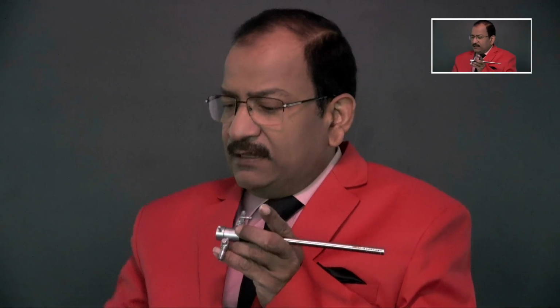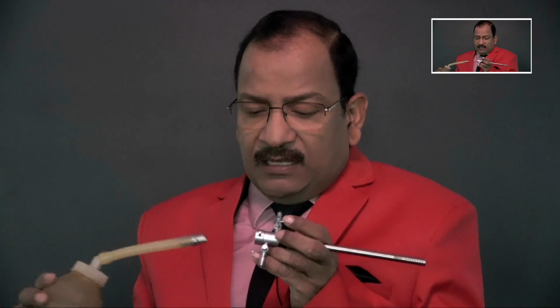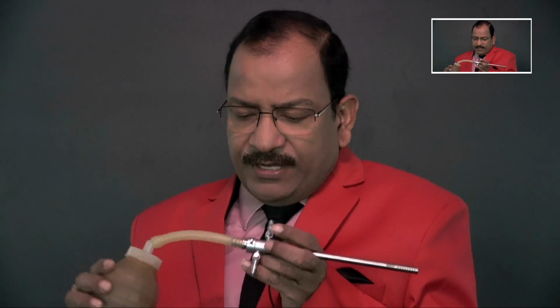So, you should never remove this cannula often. It should be removed at the end of operative hysteroscopy. And suppose I have done some resection, then this is called... sorry, Ellik evacuator. The Medex pump was there. This is called the Ellik evacuator. And you will attach this Ellik evacuator and then you pump it like this.